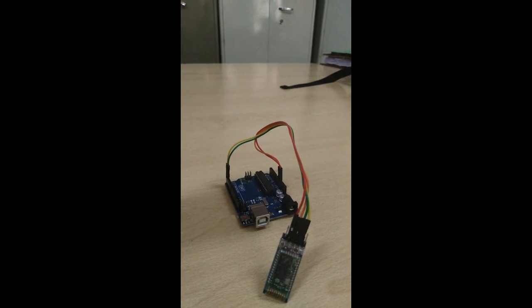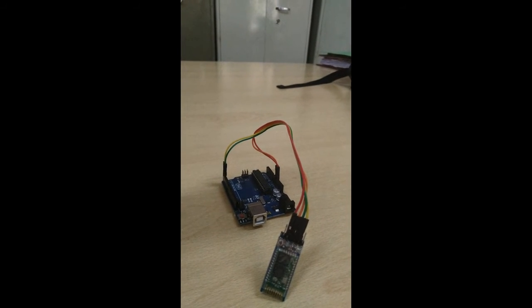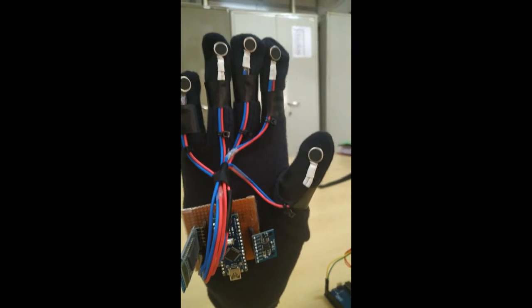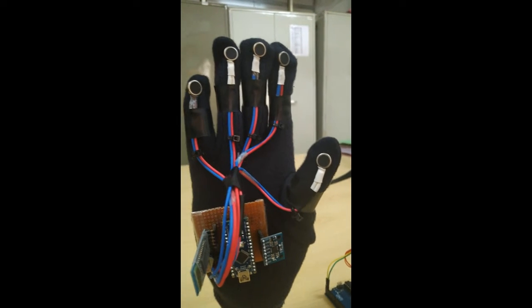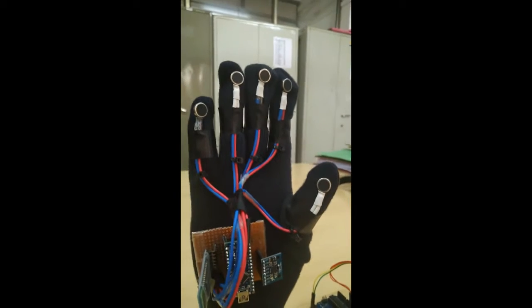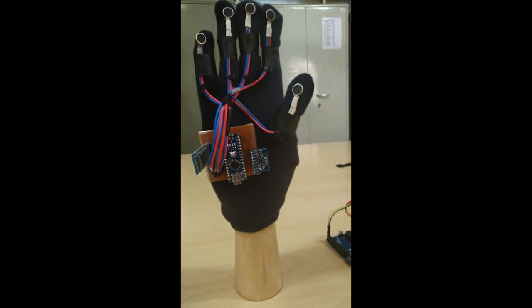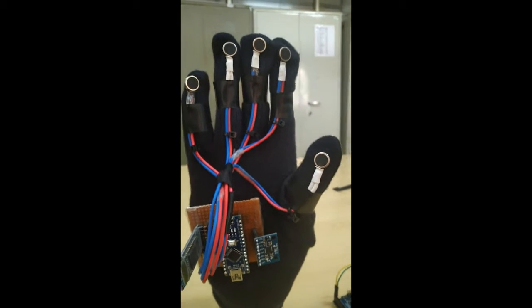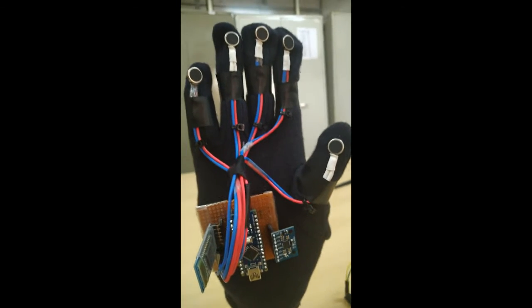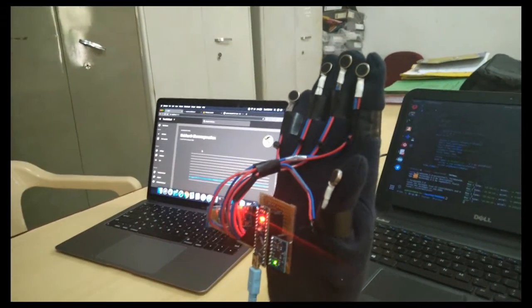All these setups are economically viable and technically very strong, and most importantly, we did not spend a lot of money building this setup. This is exactly replicating and emulating the real hand, and maybe we will have to use better materials whenever we implement it for the end user, and we may have to customize it a little bit. But now this is sufficient for us to make you understand how exactly our glove works. The next part is going to be the complete demo of how this glove works perfectly. Stay tuned. Here you go with the complete working demo.